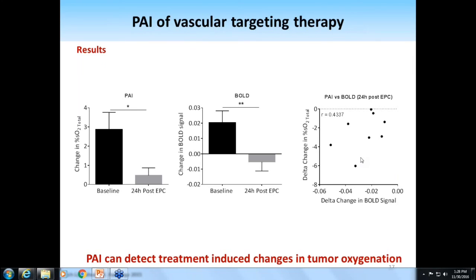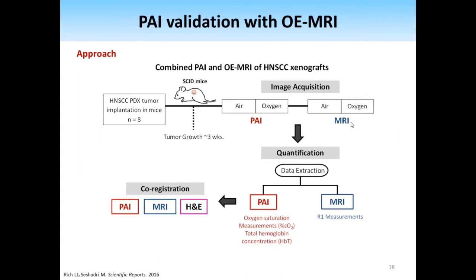But overall, what we wanted to conclude is that photoacoustic imaging can detect these treatment-induced changes in tumor oxygenation. So for the second study, we wanted to move into our oxygen-enhanced imaging.